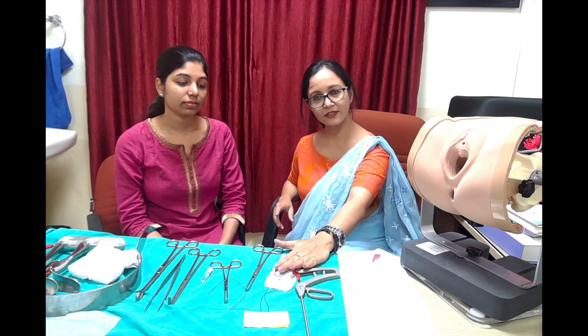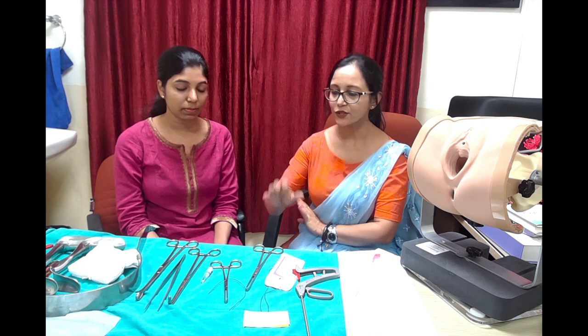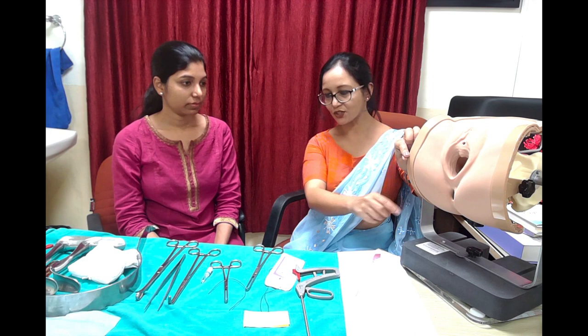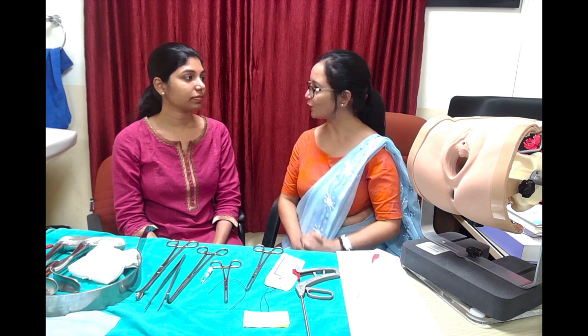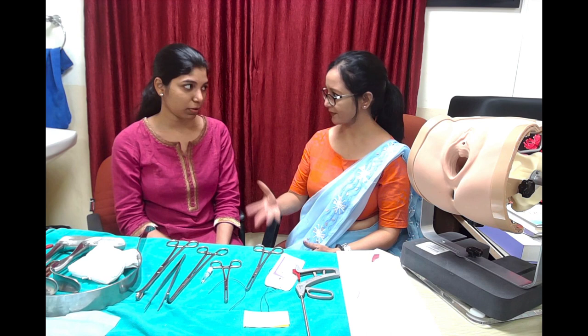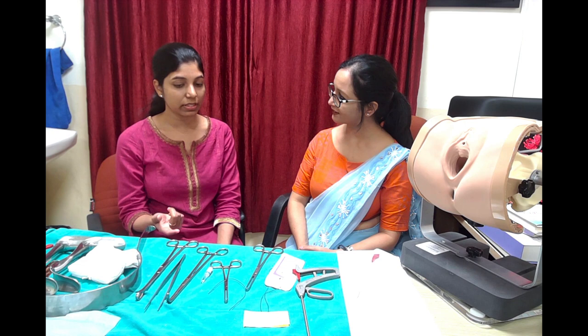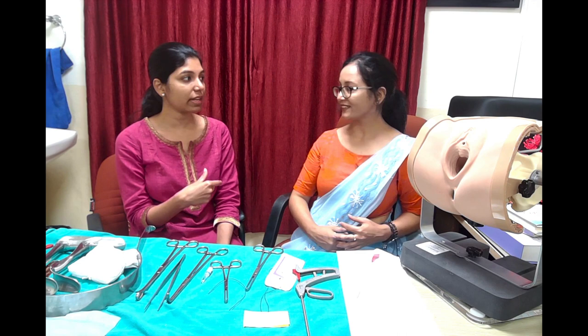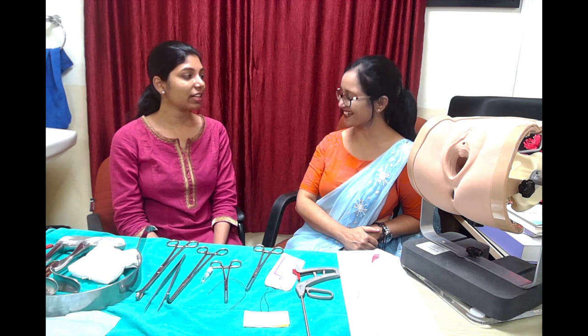Vicryl dissolves in six to eight weeks and PDS gets absorbed in around six months. Once you have taken the two bites and tagged the sutures, you continue with the rest of the procedure — completing the cystocele or rectocele repair — and then during vaginal closure, you fix the sutures to the vaginal vault apex, lateral suture to the lateral side and medial to the medial side.